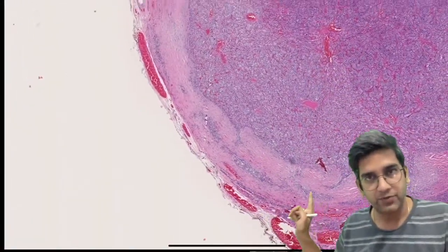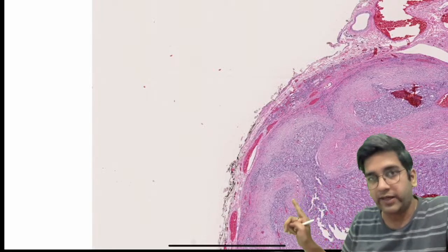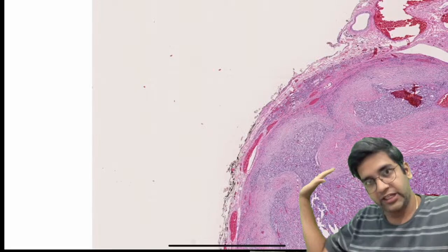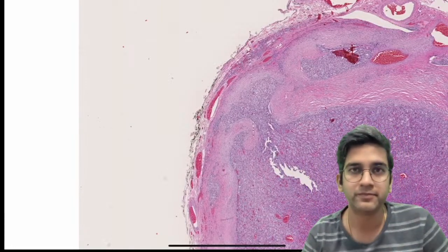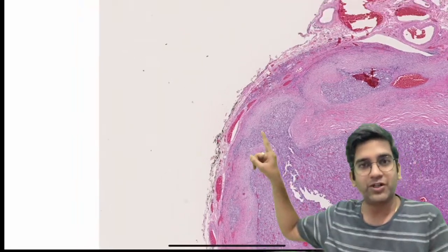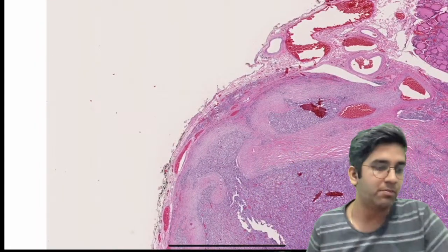At the same time, let's go and have a look again. Look at this. Capsule, outline. Now tell me, what should have been the normal outline? Merge here or take a bump like this? Again, I'll give an example. Merging here is A and going a bump up is B. Which is the normal capsular outline here? Merging or going up? Obviously merging, right? So now this mushrooming is by default invasion, because it's outside my normal capsular outline. Perfect. So you should never have a doubt with capsular outline going forward, right?